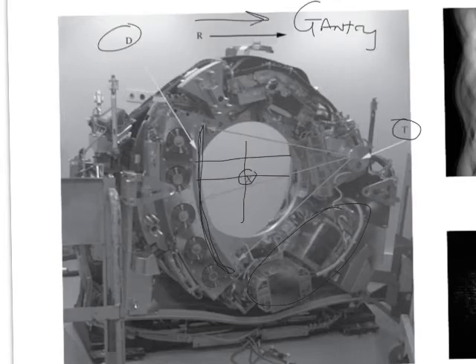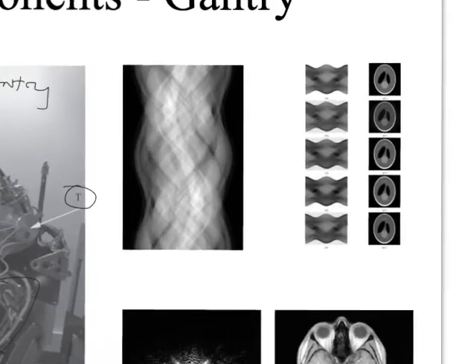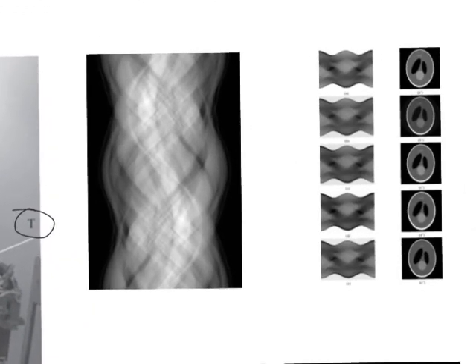Okay, let's talk a little bit about this crazy looking thing, because this is another way of thinking about the raw data. This crazy smoke trail thing is what we're going to call a sinogram, S-I-N-O gram. These pictures may look a little familiar to us down here, because here we have that projection process being interpreted again.